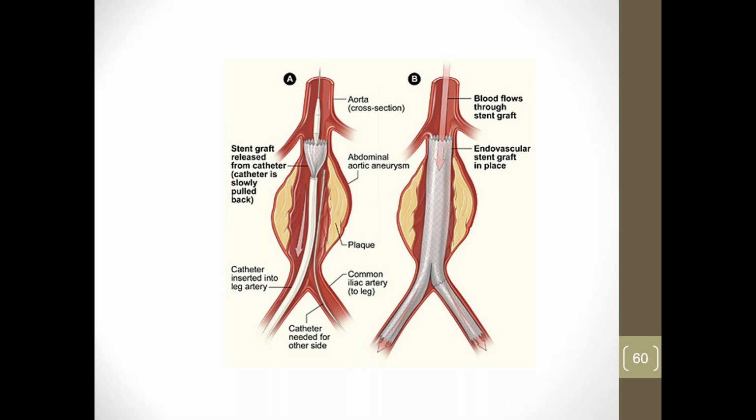Really interesting about those stents, if anyone that's been in the cath lab, the stents are tiny. They look like little tiny Chinese finger cups. These guys, they actually took one out of the package, and they're about yay long, and they're the size of a garden hose. I had no idea that the aorta was that big of a vessel, but those stents are huge. So this is a pretty big deal. If that cuts loose, then yeah, you're not in a good place.